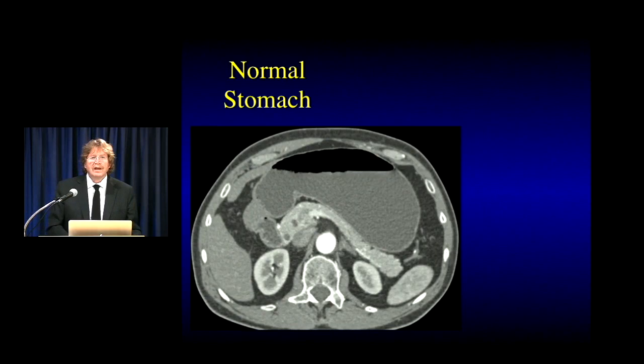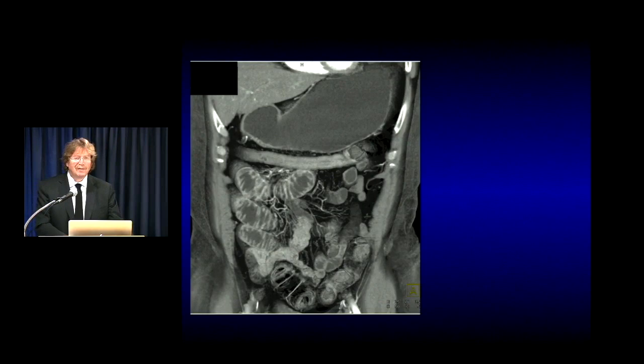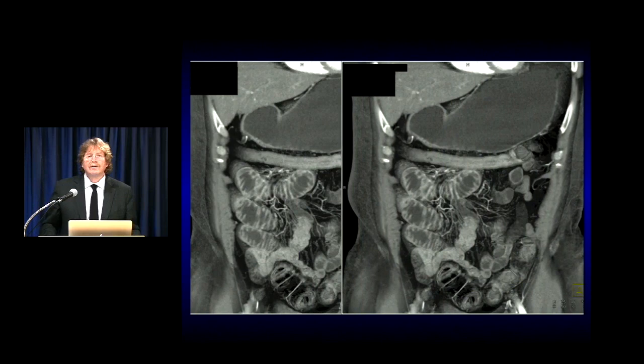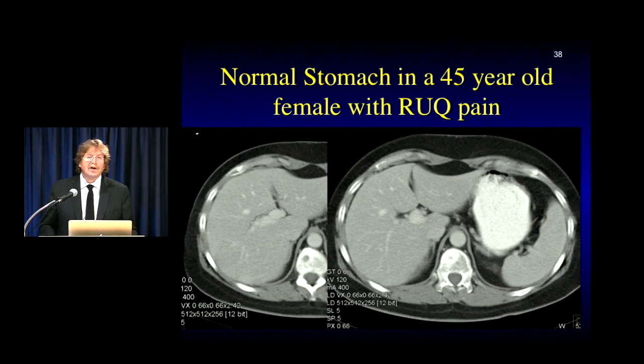Here's a good example of a nicely distended stomach with water. You can see the pancreas nicely, and the wall is barely measurable — just a few millimeters. This patient has a thick transverse colon, but look how nice the stomach is. Whether you're using water or positive contrast like oral Omnipaque, a well-distended stomach shows no wall thickening, no pathology, no confusion.